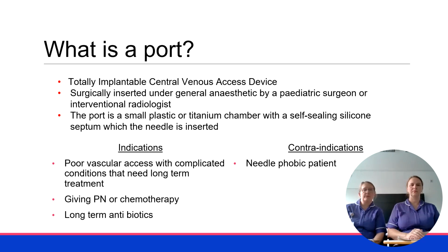So what is a port? It is a totally implantable central venous access device. It is usually inserted surgically under a general anaesthetic by a paediatric surgeon or interventional radiologist. And the port is a small plastic or titanium chamber with a self-sealing silicone septum which the needle is inserted into.